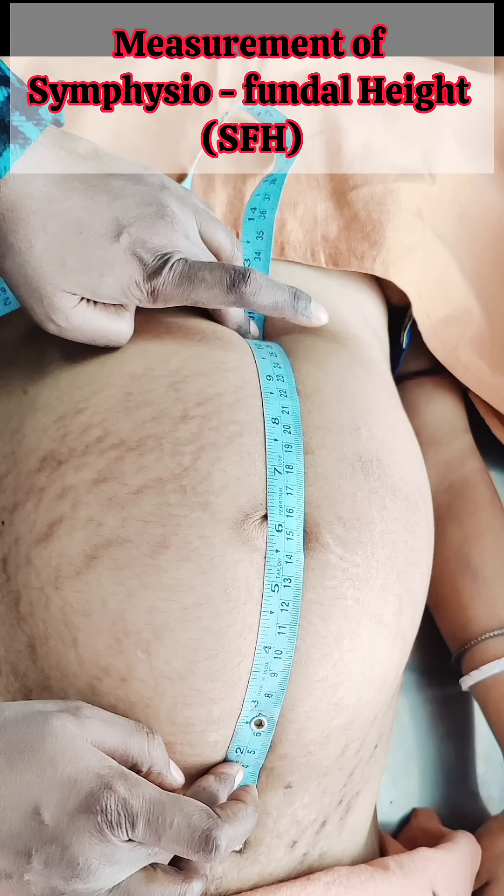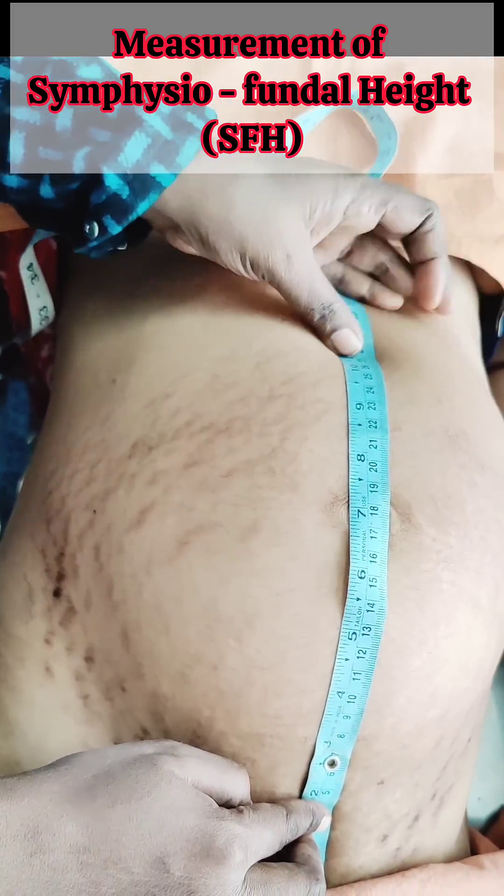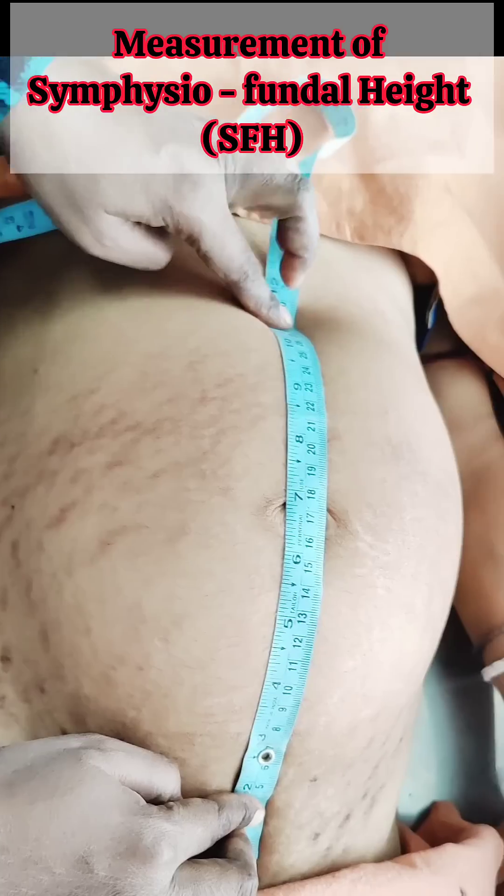During this procedure, the bladder should be empty within 30 minutes before examination. Symphysiofundal height is measured in the supine position with legs extended. The zero mark of the tape is placed over the uppermost border of symphysis pubis, and the tape is run along the midline of the woman's abdomen up to the highest level of fundus.